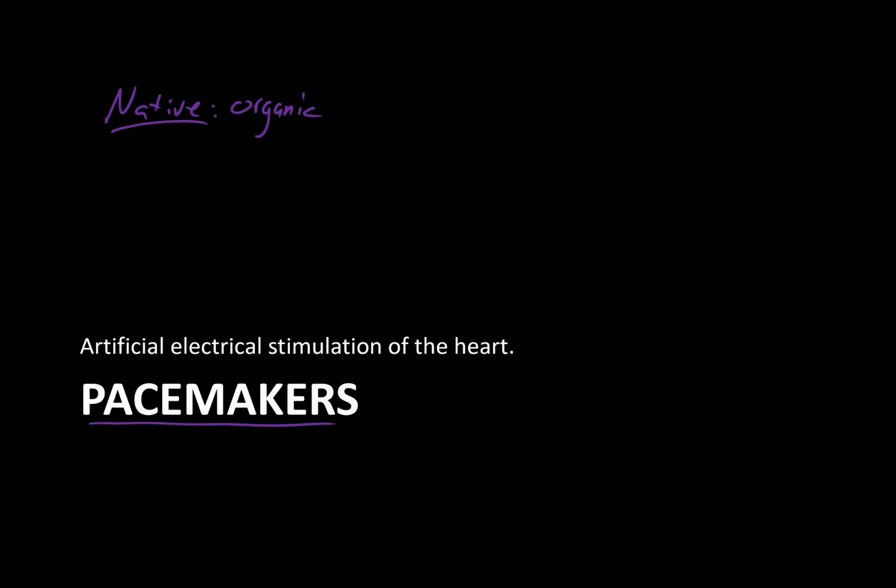With this last section, we're going to talk about the artificial pacemaker, or pacemakers, the ones that are implanted by the healthcare industry. So we'll talk about those in various ways.